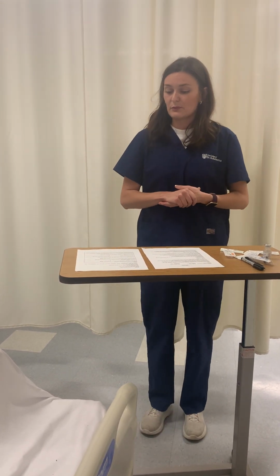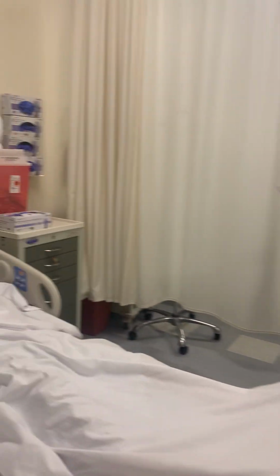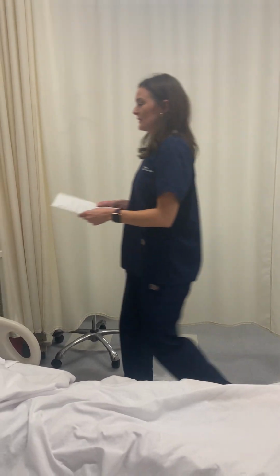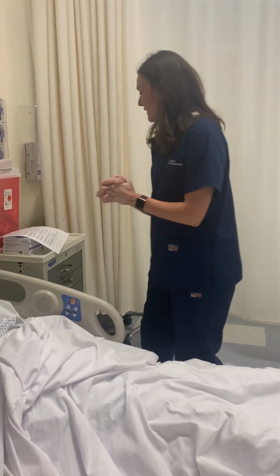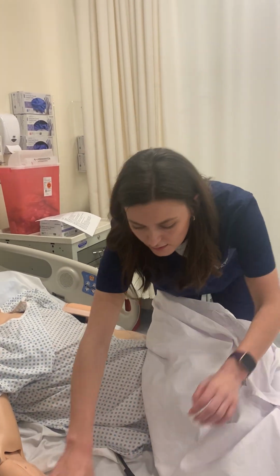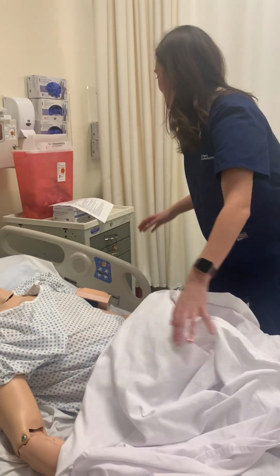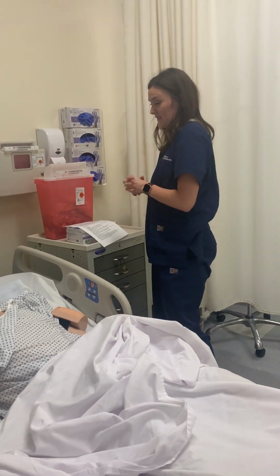I'm going to go into the client's room and I am going to see how they feel about receiving a vaccine. Hi, my name is Raylan. I'll be your student nurse today. Provide privacy. I'm going to do hand hygiene. Before we begin, would you give me your name and date of birth, please? Joanne Peterson, 12/10/47. Let me see your wristband. Nice, there you go. Matches the EHR, very good. Do you have any known allergies? No. Okay, that's what my chart says also.